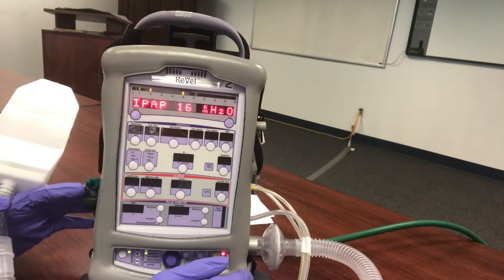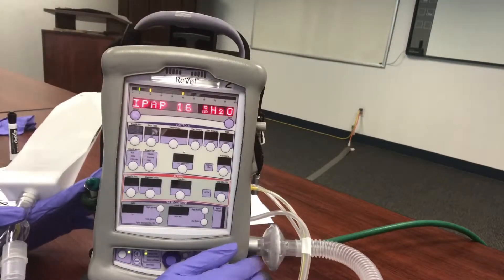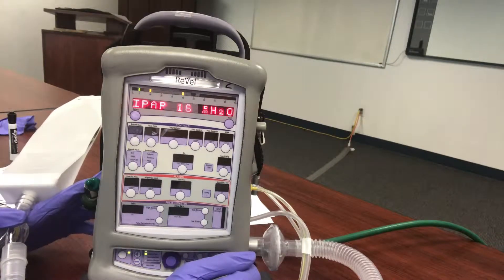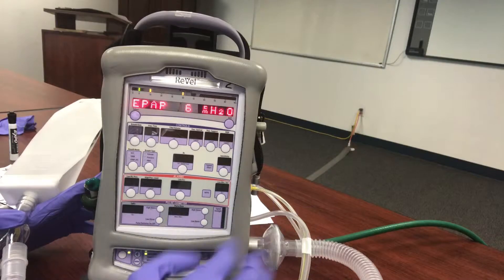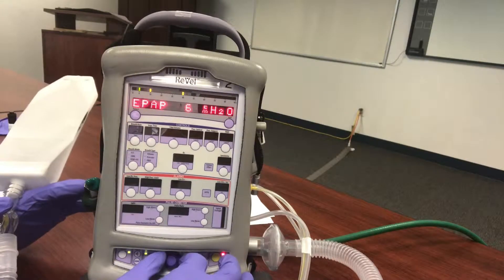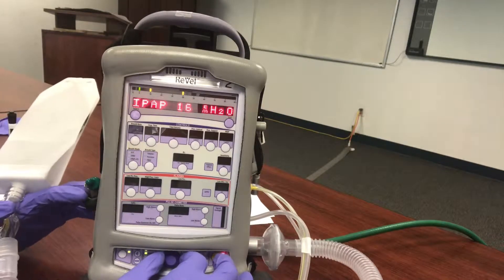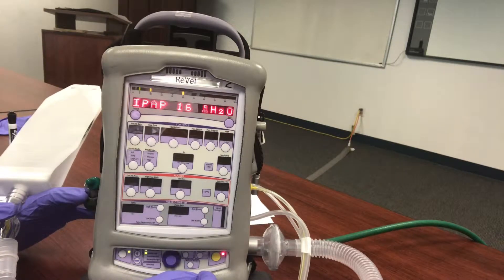From here you'll see the first settings — and of course this should all be on the test lung when you're doing this. We have our first setting: IPAP. IPAP is the inspiratory pressure we're going to use to deliver the ventilation — the default is 16. Our default EPAP, which is the CPAP that keeps the lungs open, is 6. These are just default settings; you can set whatever you want. If the hospital gives you settings like 10 over 5, this is where you dial those in.